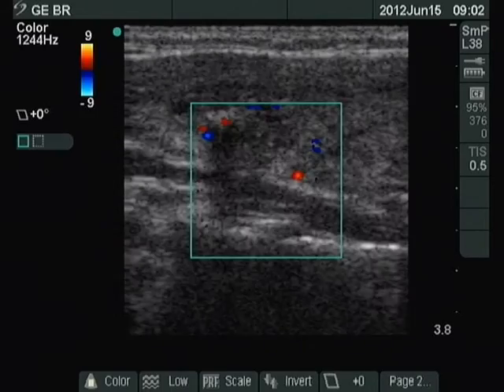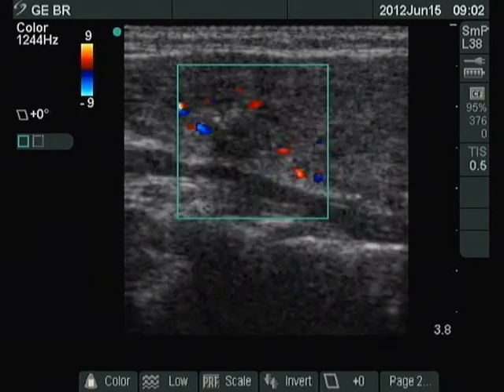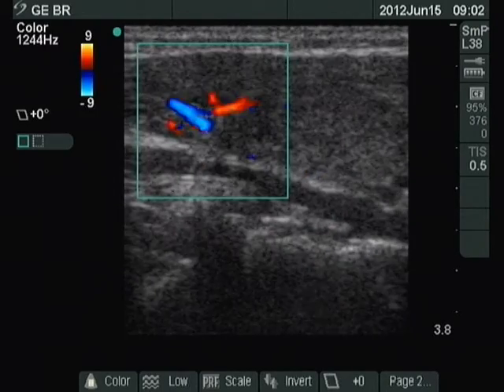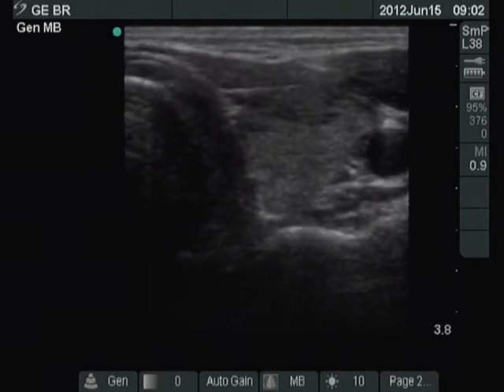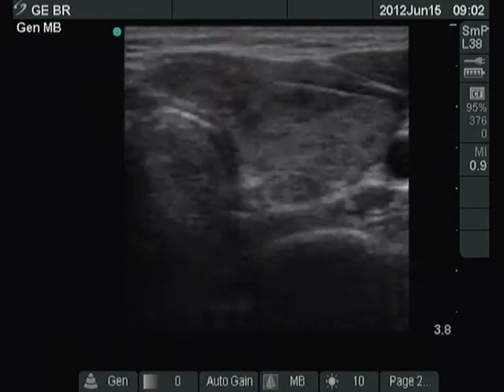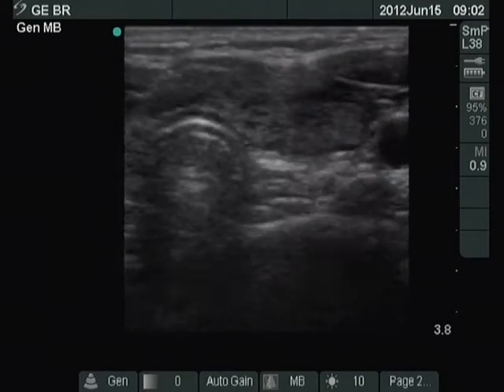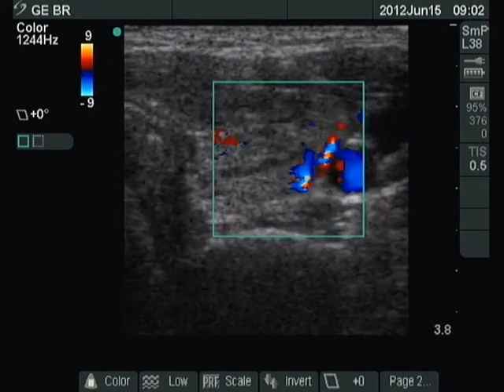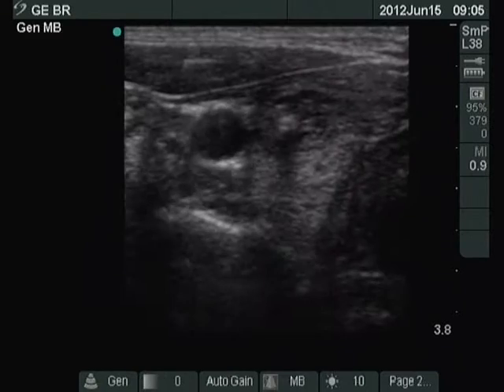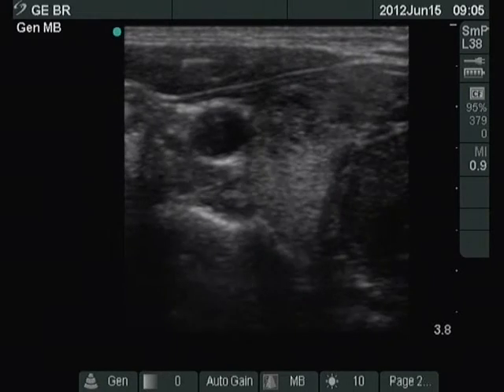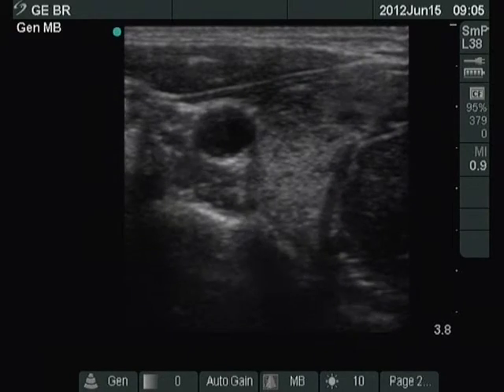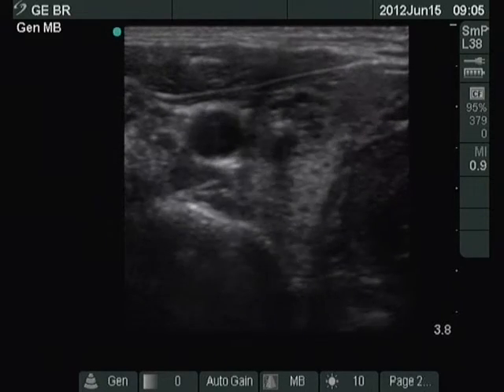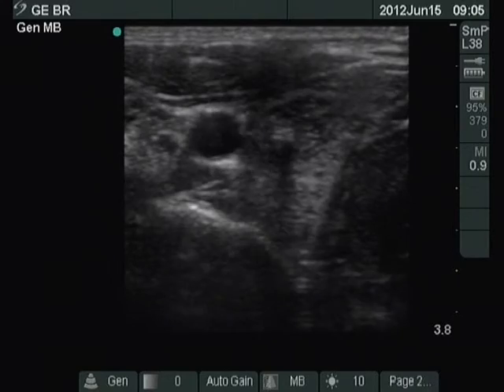Note the presence of microcalcifications in the puzzle-like borders. The echo structure of the left lobe is identical to that seen in the contralateral lobe. The tip of the needle can be easily identified on US-guided aspiration.